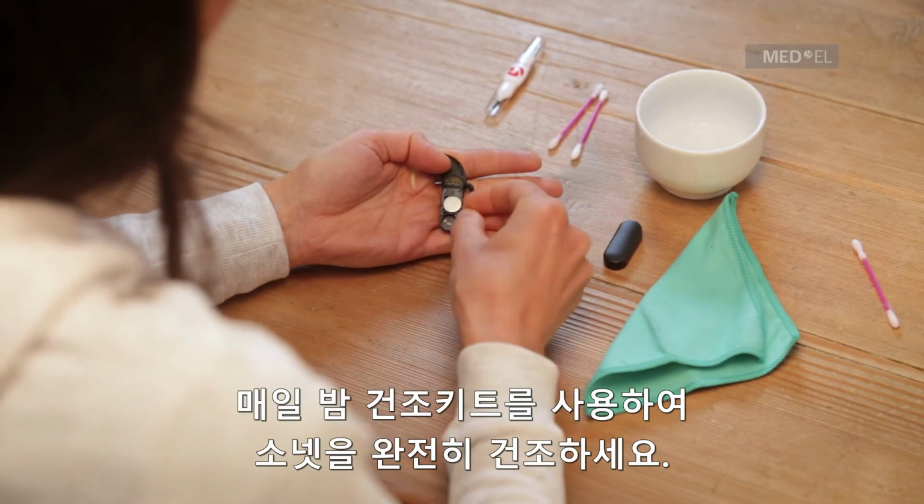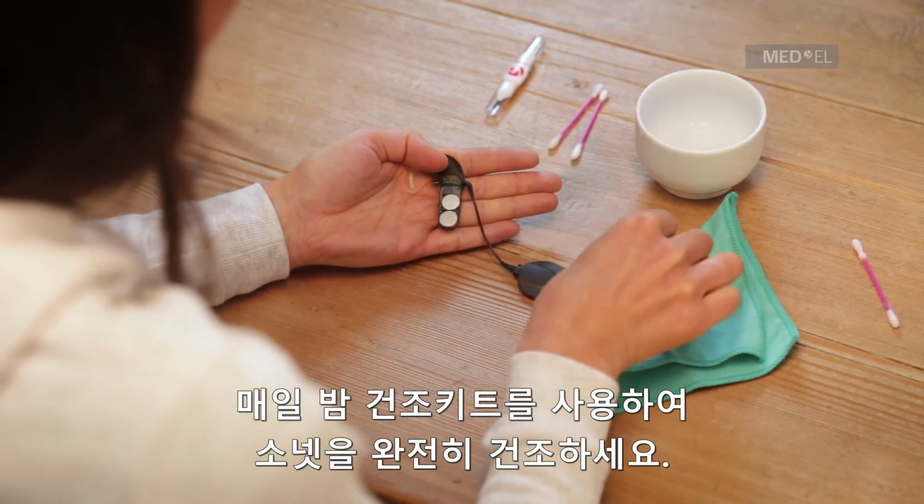Use the drying kit every night to allow your Sonnet to dry out completely.